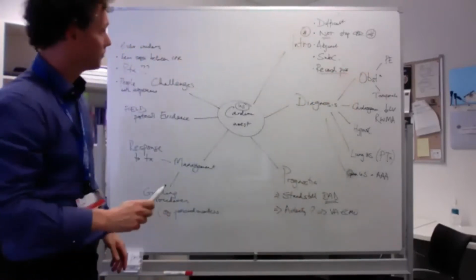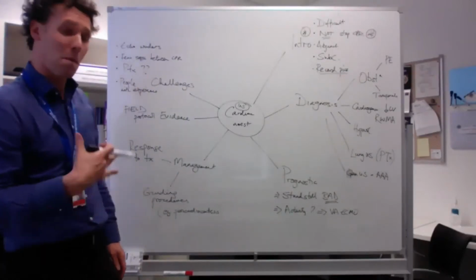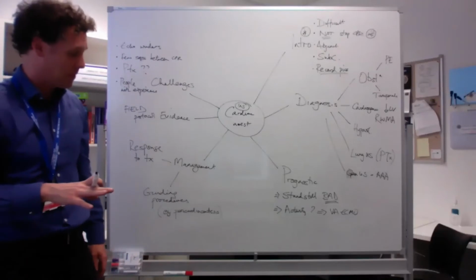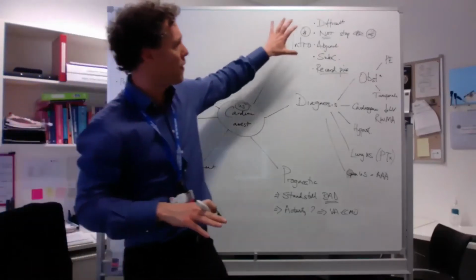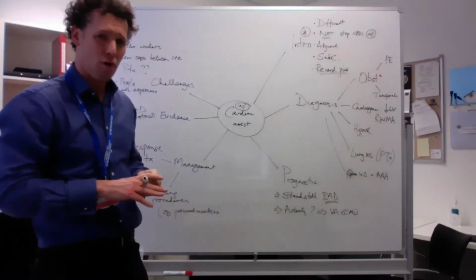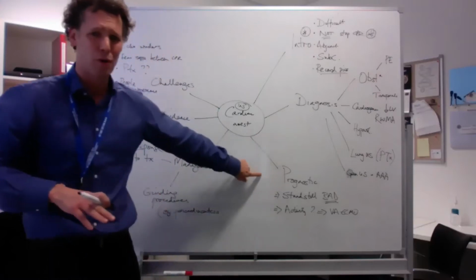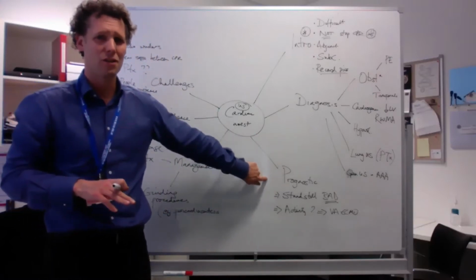Nice. I'm not suggesting that we wouldn't be able to get pictures. No, usable pictures, I suppose. I find it hard, and more often than not echo doesn't help me that much, other than with prognostication.